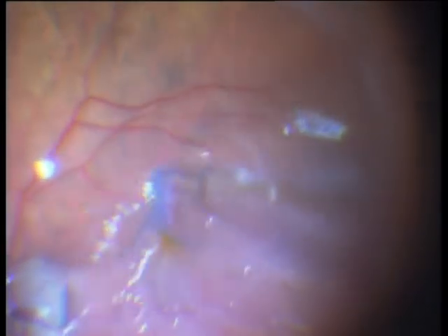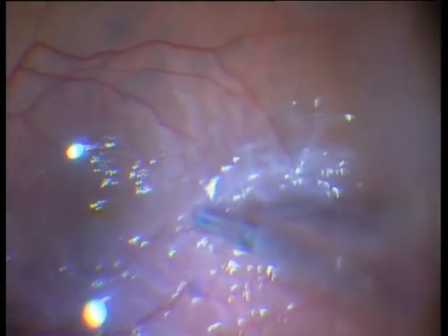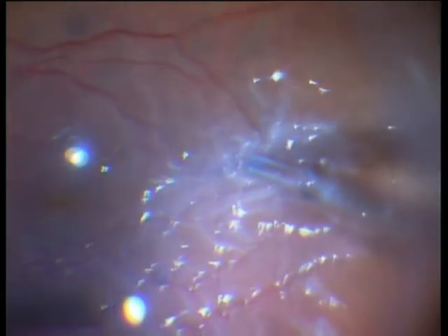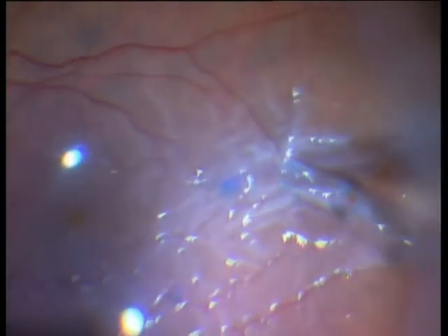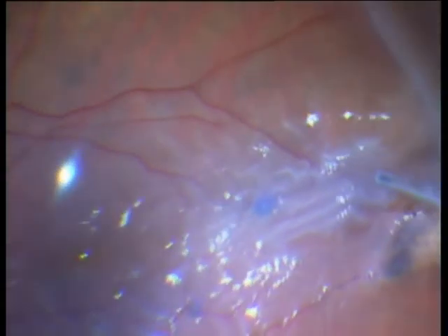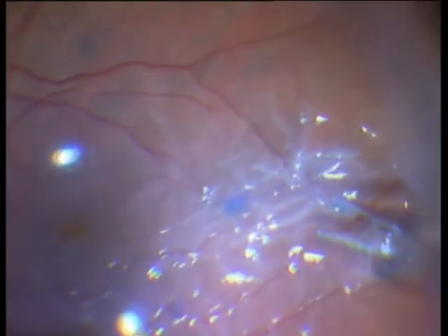Now I can remove a bigger part of the membrane. This membrane has to be removed if you want to prevent re-detachment. If you do PVR detachments, always start with peeling in the macula and then continue in the periphery. This is in contrast to a diabetic tractive detachment — in diabetics, we start in the periphery and then peel the center. So in diabetes, it is the opposite.